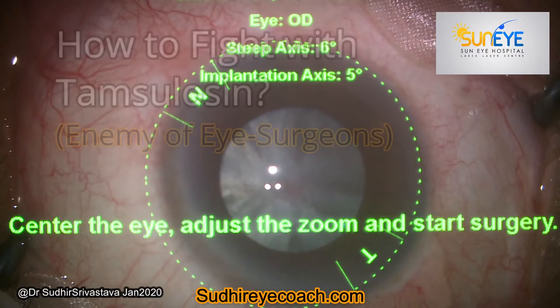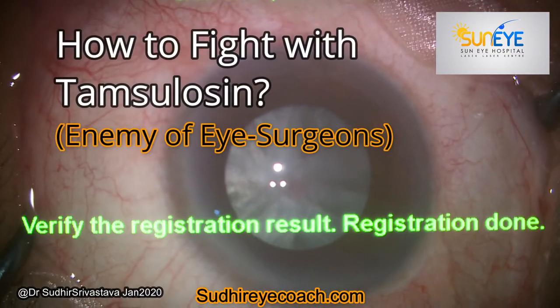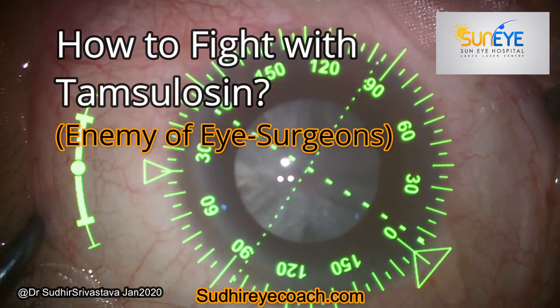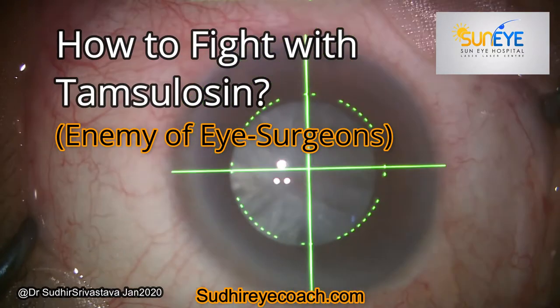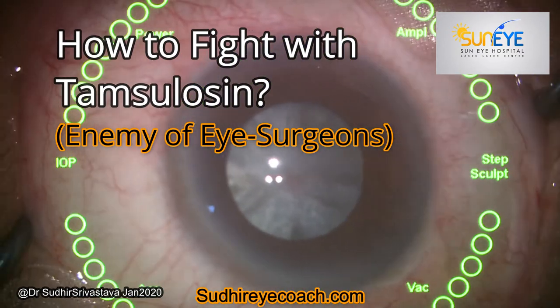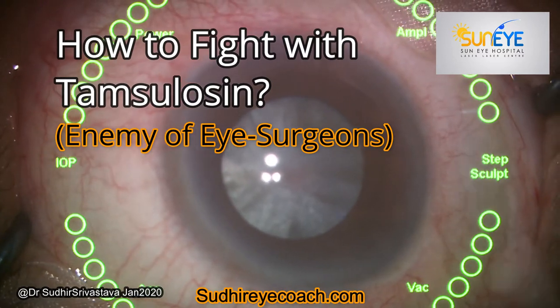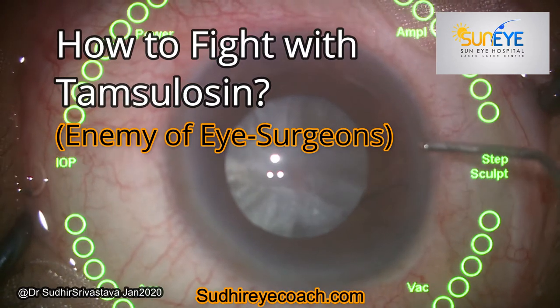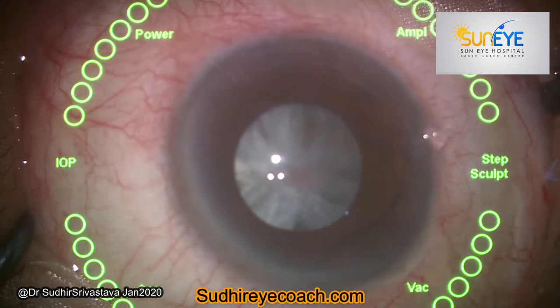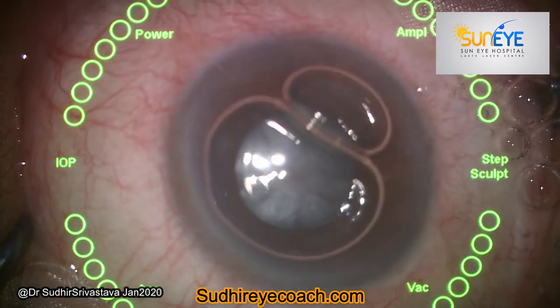Hello everyone. Today I'll be sharing a video of phacoemulsification with toric lens implantation in an old male patient who was on an alpha-1 antagonist, Tamsulosin, or Flomax.